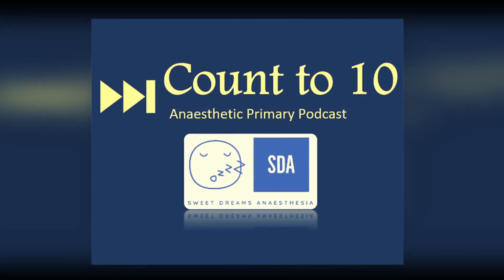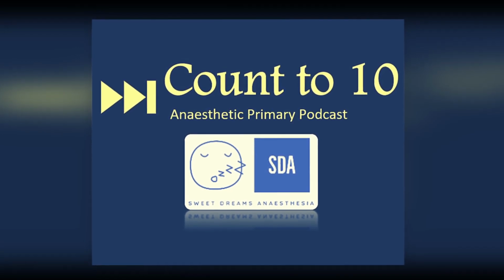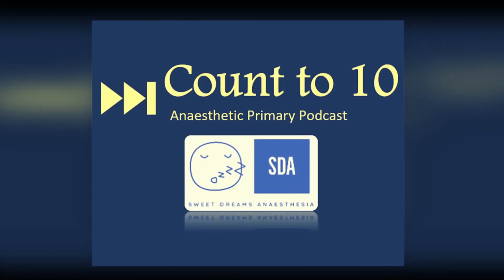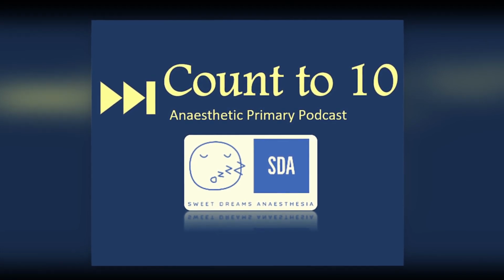When you get asked directly how does the pulse ox work, I would use a nice simple definition like we did at the start of the pod, and then say that it has a few fundamental principles that it uses, mainly the Beer and Lambert law, and the differing absorbance of oxyhemoglobin compared to deoxyhemoglobin.